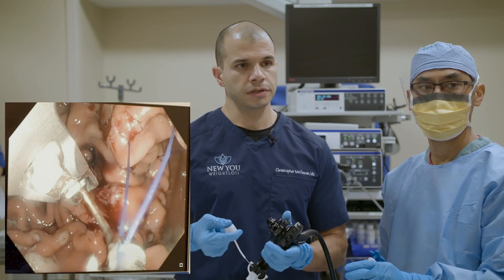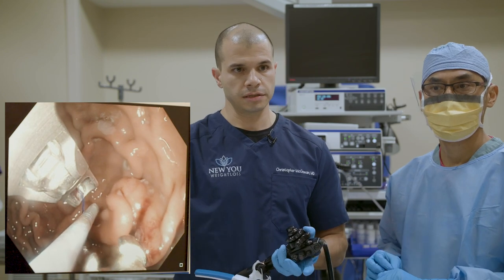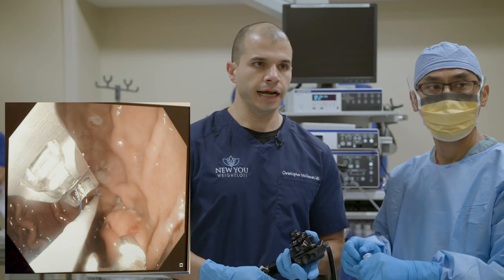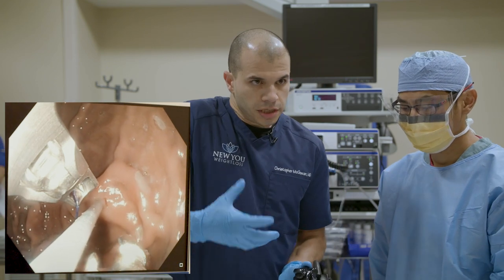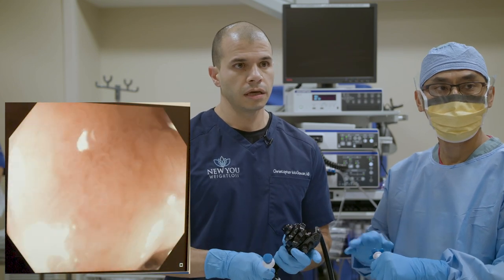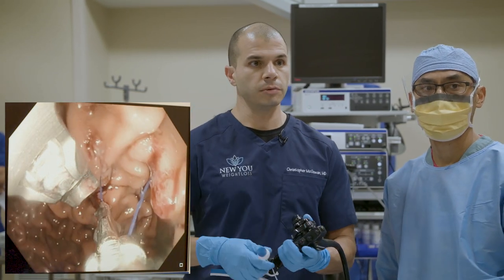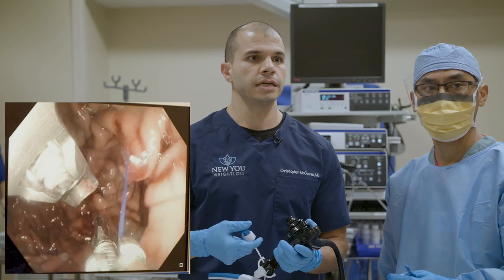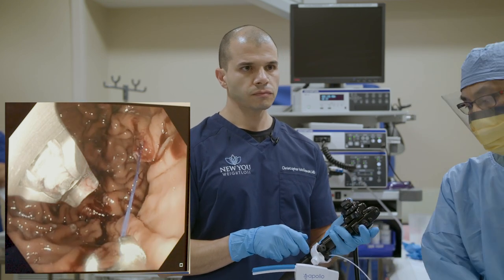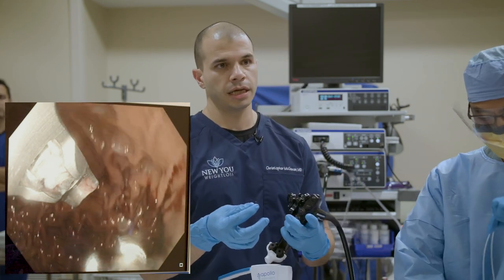The stomach is actually 50% shorter when we're finished with this procedure — a key difference. We also don't touch the top of the stomach. The end result is a stomach with a little cap on top and then very narrow below that. We're done with this U-shape and ready to tighten the suture. I can't hand-tie the suture, so we use a device called a cinch that allows me to tighten the suture and then cut it so it stays permanent.